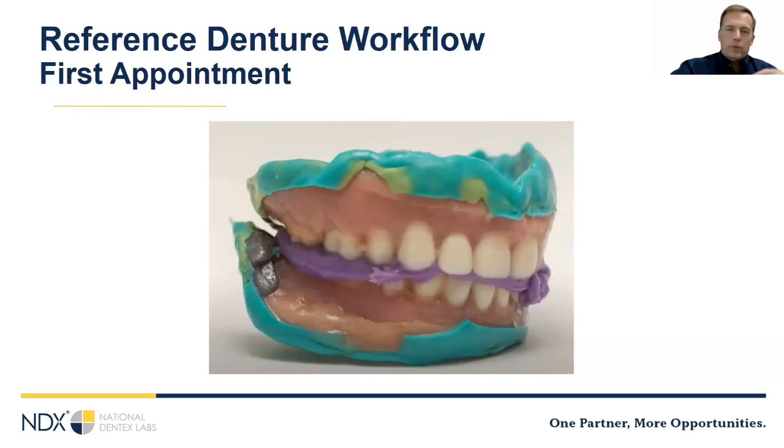Is milling always better than printing? Good question. And we'll address it in just a minute, but what I would say is that with first generation printed materials, the milled materials were so much stronger that it was worth putting up with some of the problems that come with milling. But I would say with the second generation materials, from a philosophical perspective, printing is always better than milling because you're just making what you need. You're not subtracting a bunch of stuff that basically wastes time to get to what you want. And there's a question about immediate digital workflows with immediate dentures, and I'll cover that in just a minute.